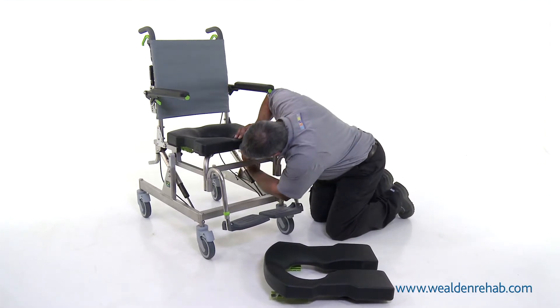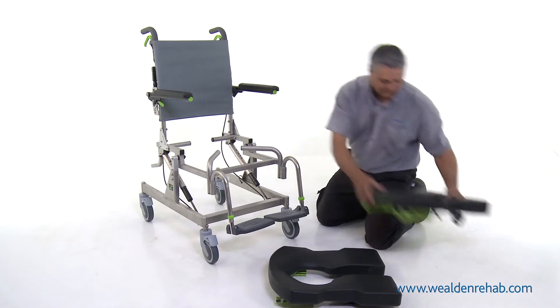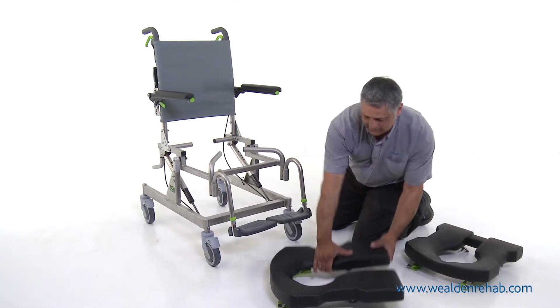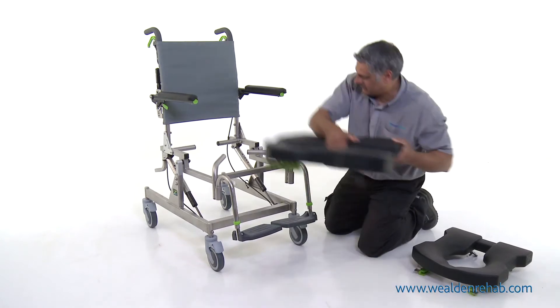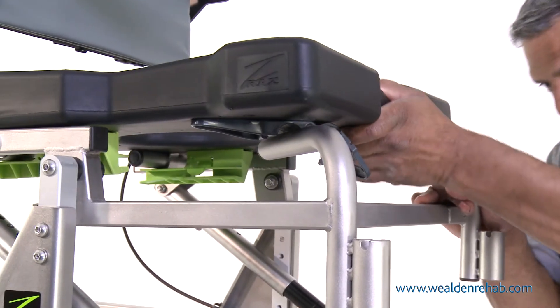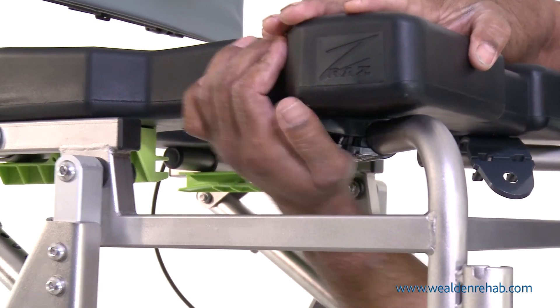No tools are required for changing the seat. Simply undo the two grey plastic clips underneath the seat, remove, and replace with an alternative seat making sure the clips are undone. Slide the seat in using the green plastic guides at the rear and click the two grey plastic clips back into place.